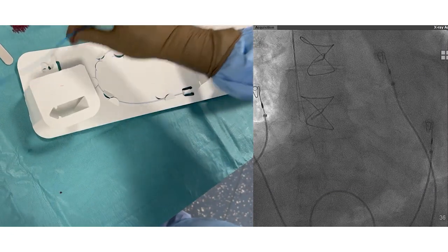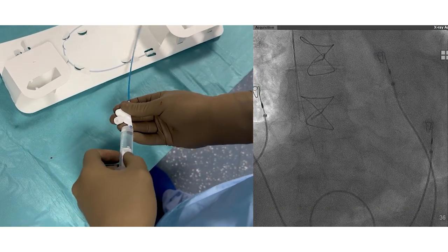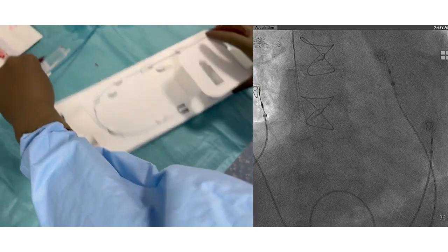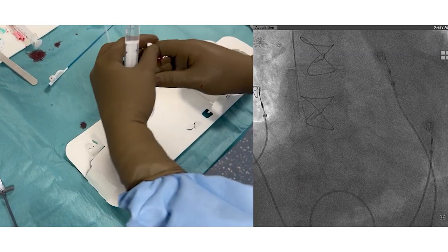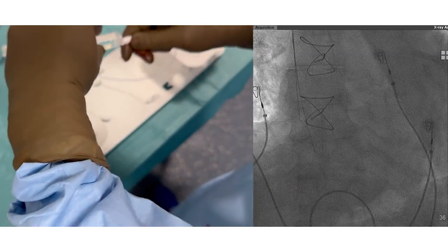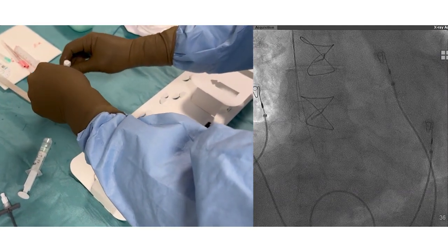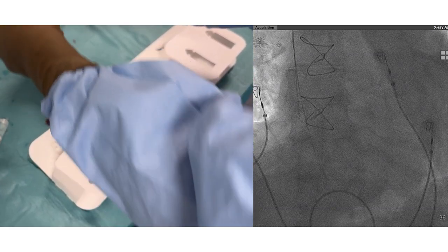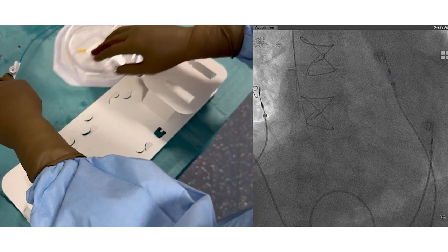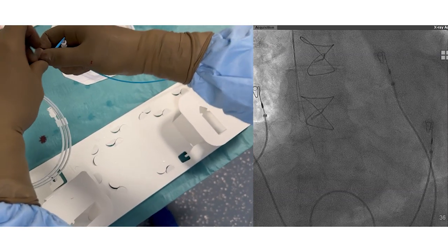In this video we will show you how to perform left bundle branch area pacing in a patient requiring His-bundle ablation. A popular approach is with the C315 His guiding catheter, which is a non-deflectable guiding catheter with 7 French exterior diameter and is 43 centimeters in length. It is used to deliver the 3830 SelectSecure pacing lead, also from Medtronic.